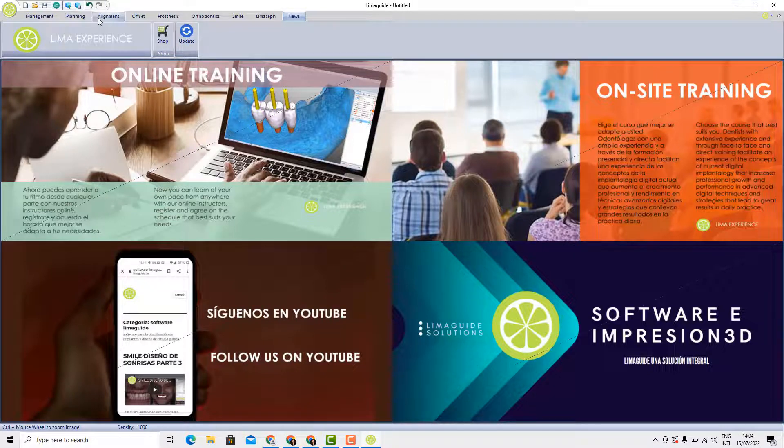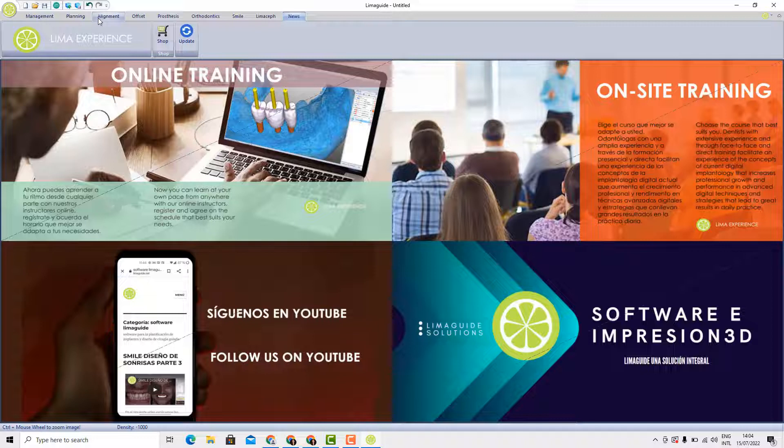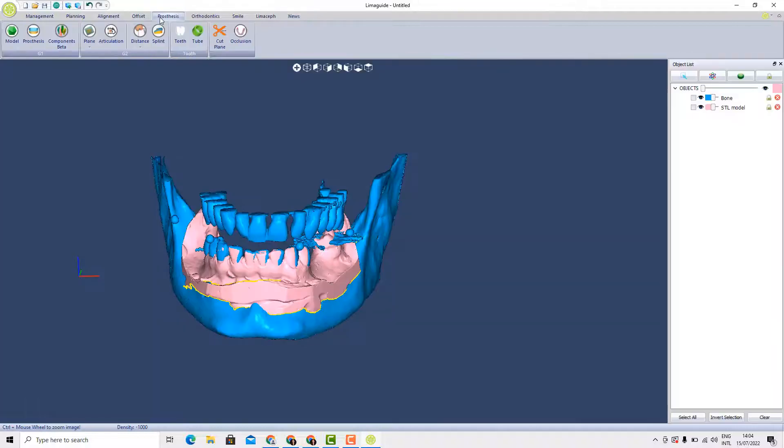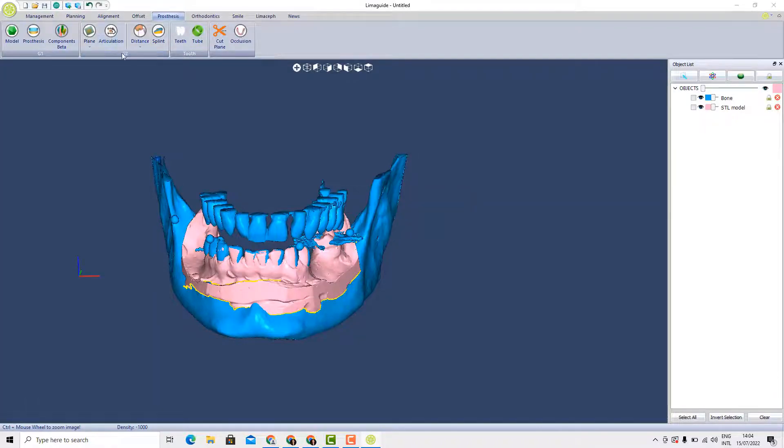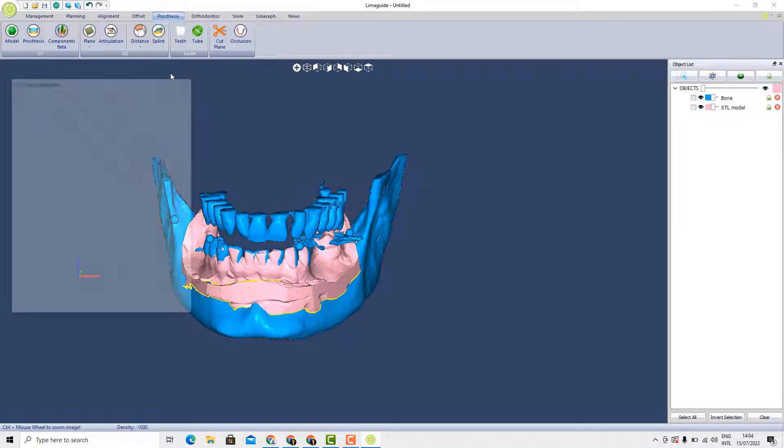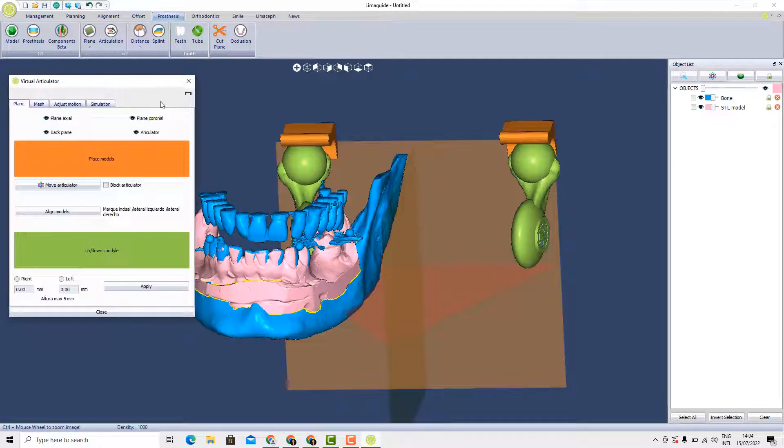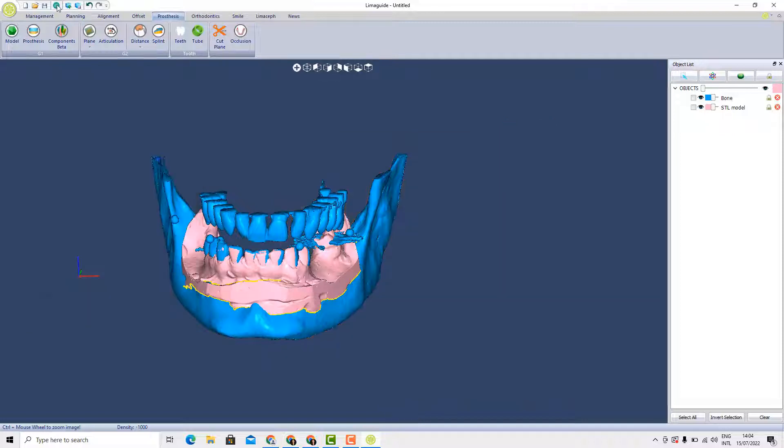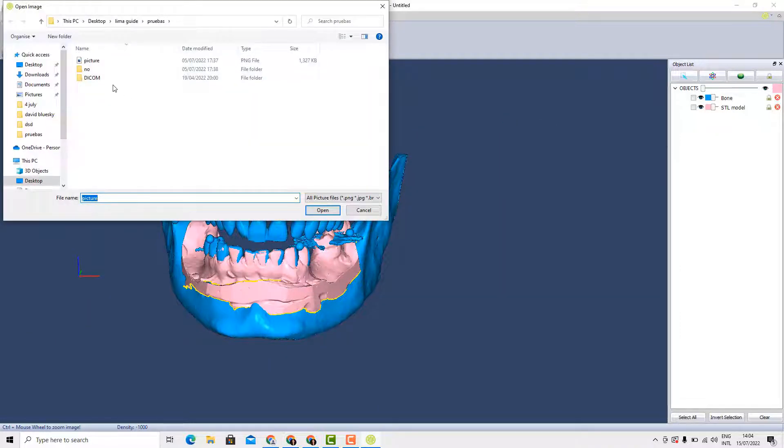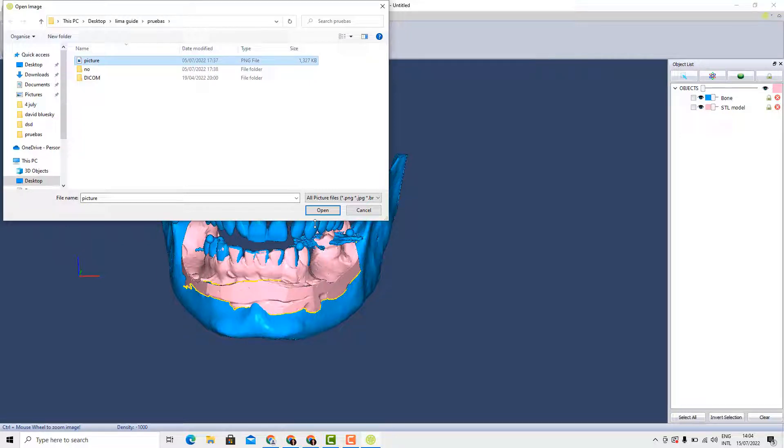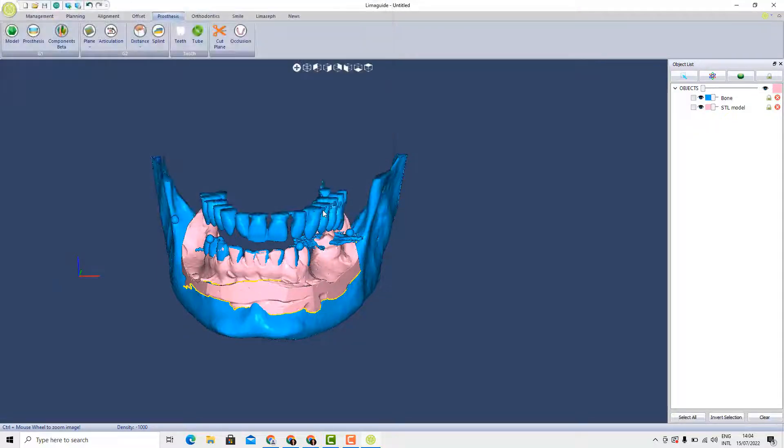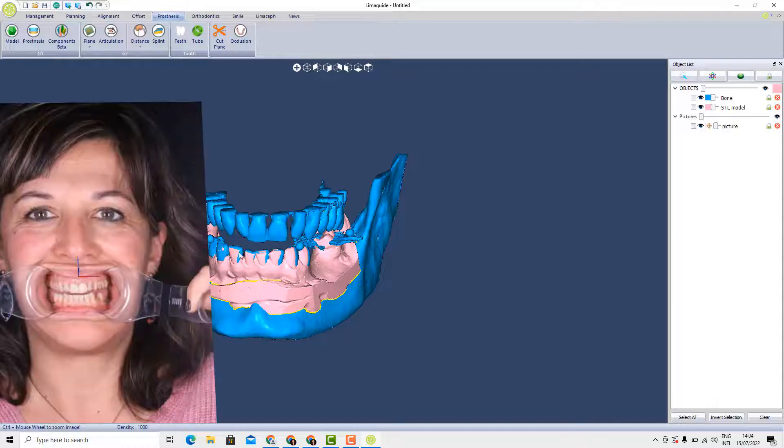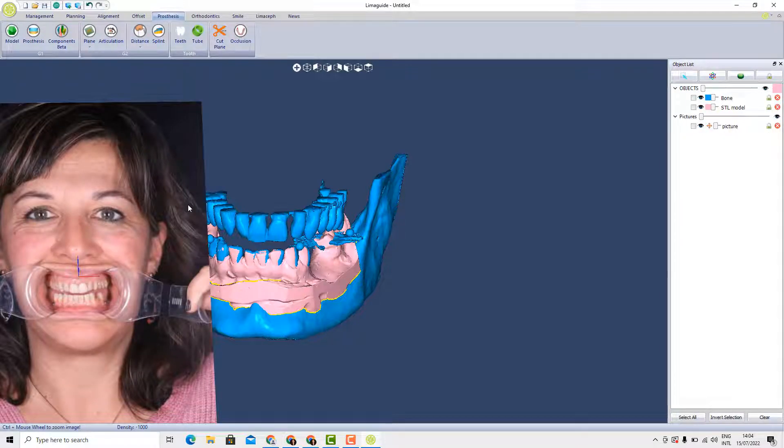Also by buying the software, you will be able to have access to specific tools that are only activated once you buy the annual subscription for Lima guide. For example, in the prosthesis section, the articulated option is only available and active once you shop the license of Lima guide, the annual license. Or for example, if you would like to import a certain photo of the patient to align it with the jaw, with the STL and with the DICOM, with the CBCT that has already been taken, you need to have the license activated.